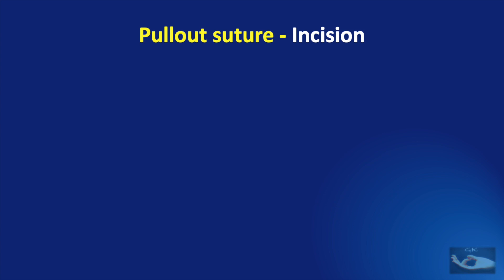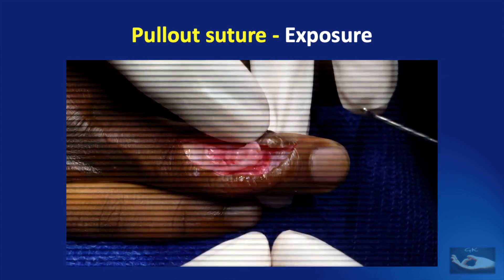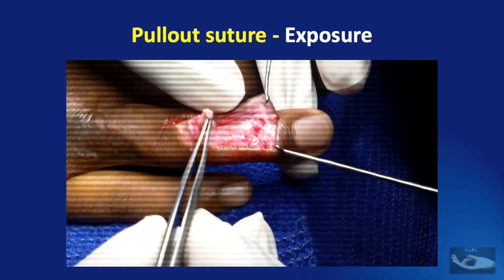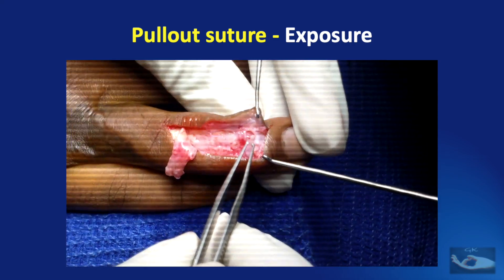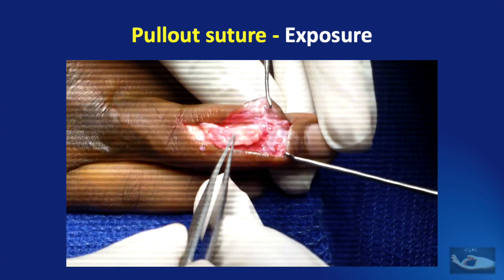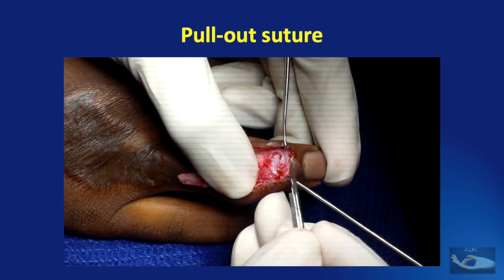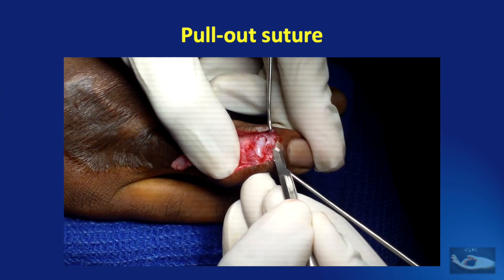The incision was made as planned, and both ends were retracted. The tendon was identified. I am planning to reattach this tendon to the terminal phalanx base. I dissected the base — this is the joint, you can make out the open joint of the distal interphalangeal joint — and this is the base of the terminal phalanx where I am going to attach the tendon. First we need to dissect the base of the terminal phalanx and make it raw. We use a number 15 blade to shave the articular cartilage and then nibble a bit of bone so that the tendon can get attached to a raw area on the bone.